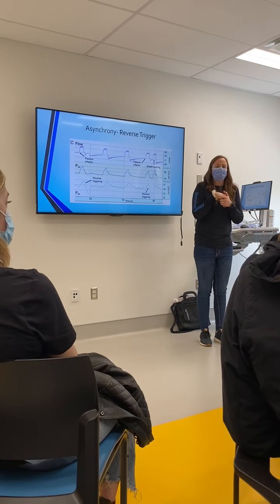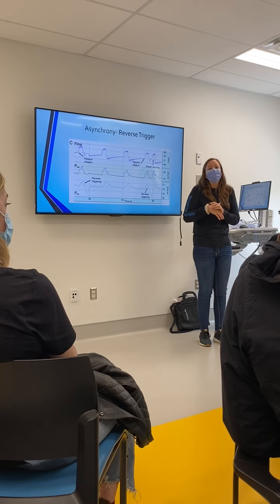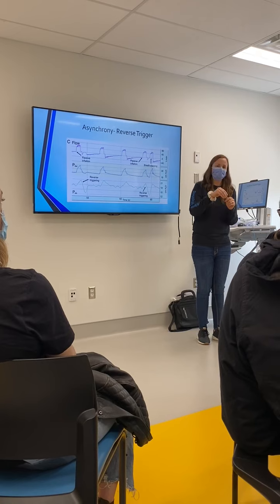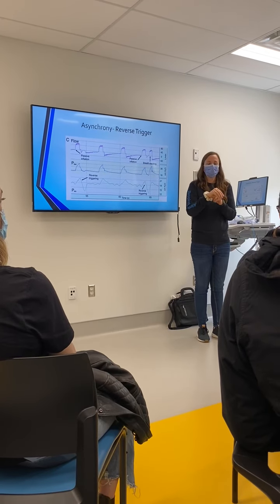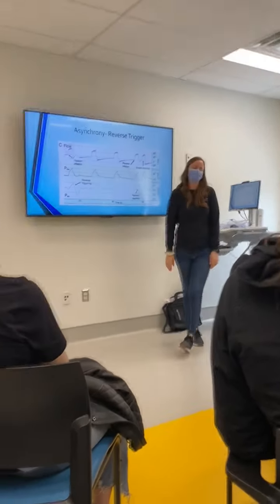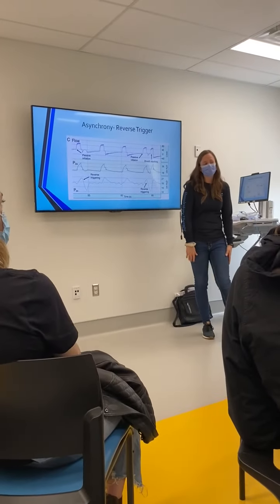Yeah, you at least have the starting point and then you just adjust. You just have to make sure that happens quickly, like you do one right before you prone them and right after you prone them. But can it go the opposite way, where it'd be less? Yep. I don't know which way it went, but I'm just giving an example. Yeah. Cool. That's a good point.